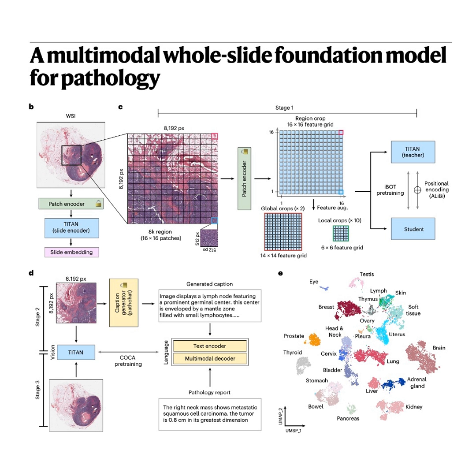That is a perfect analogy. And these feature summaries, these vectors, they're then arranged into this huge 2D feature grid that perfectly replicates the tissue's physical layout on the slide. So it preserves all that crucial spatial information that the patch-based models would just ignore. Exactly. It keeps the context. So that's the key then, context. How does it actually learn those spatial relationships in this massive grid?